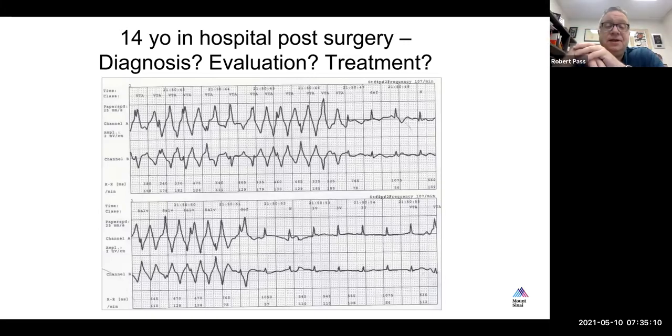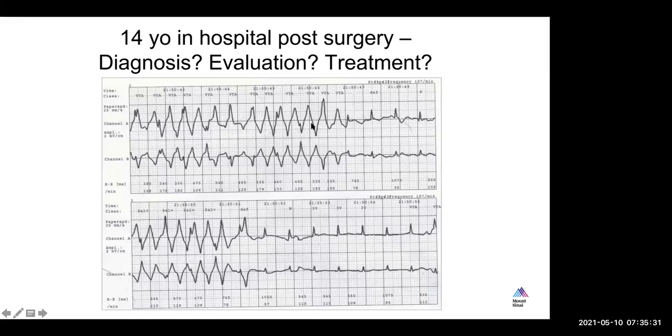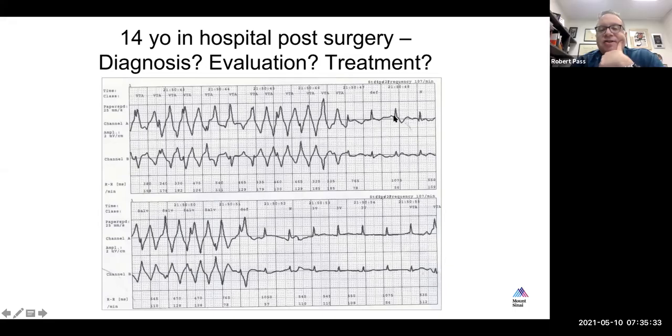Right. So what you would do in a case like this is take out your calipers. And this is just artifact. This is somebody who's in sinus rhythm and you can almost see them, right? This looks like one of those beats. And if you look at this R to R interval, it's very similar to this. Very unusual to have a ventricular arrhythmia that goes into sinus without any kind of pause and then again goes back into sinus. Now, is it possible that you could be having torsade that's starting and stopping?